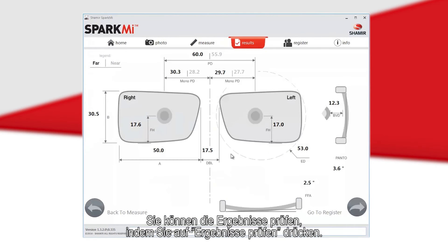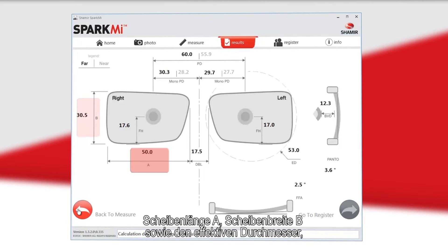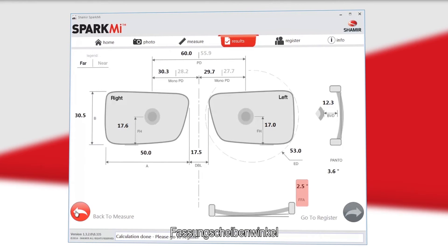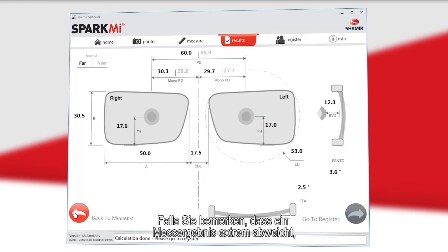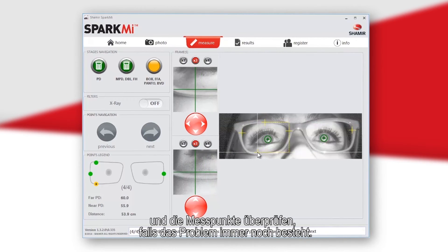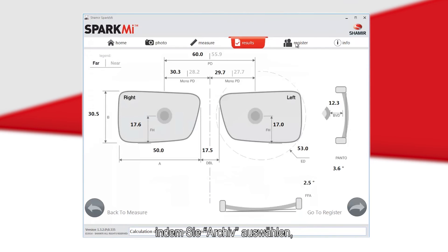You can view the results by selecting Check Results. The final results will include the patient's far and near PD and mono PD, A, B, and ED measurements, fitting height, DBL, pantoscopic tilt, panoramic angle or face form angle, and back vertex distance. If any measurement appears extremely off, this may result from not marking a point on either the upper or lower image. You can go back to the measurement screen and adjust the points if the problem persists.